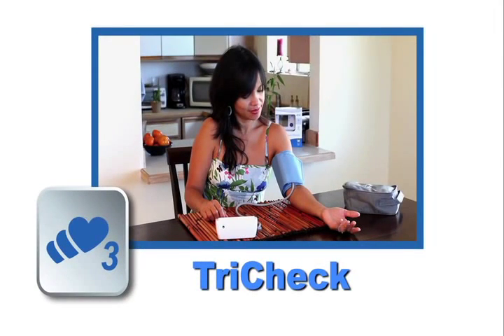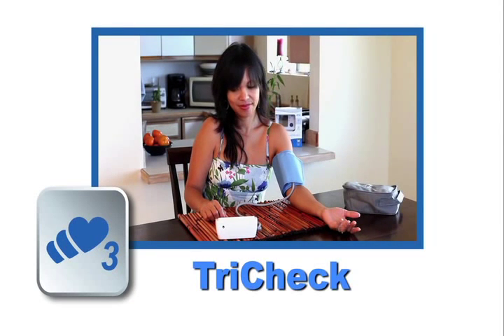If you're using TriCheck, remember to stay seated and calm while the device counts down to its remaining measurements.